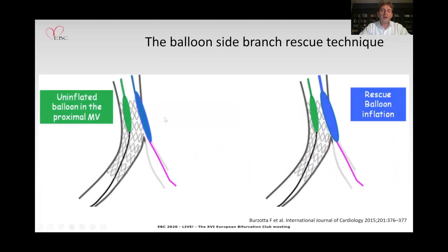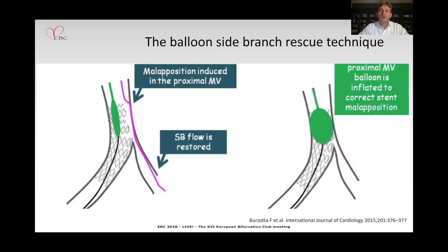But before you inflate a balloon in the side branch, it is very reasonable to position the main vessel balloon so that you are able to correct any deformation of the stent you may create with the side branch balloon. On the right-hand side you can see the side branch opening, and once the flow is restored you can access the side branch through the struts of the stent, after which you can inflate the main vessel balloon and correct the stent deformation.